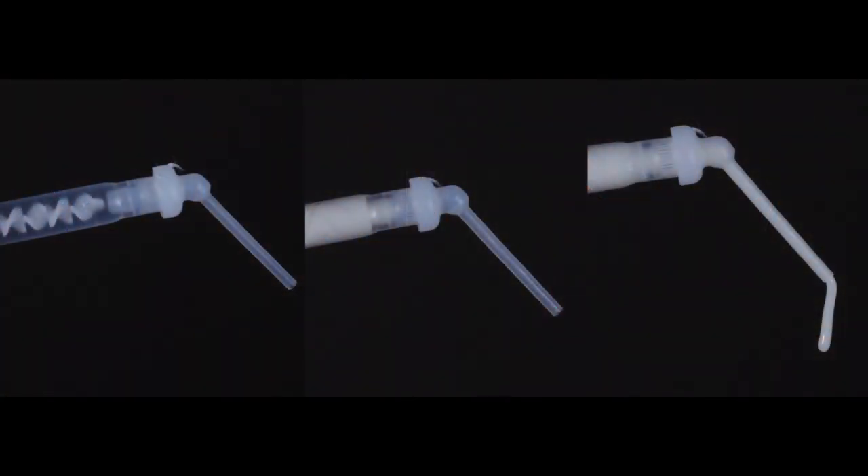One of the things I like the most about Philip is its delivery system. This auto mix tip is long and thin enough to reach the bottom of any deep class 2 box, dispensing the restorative material in an easy and predictable manner.